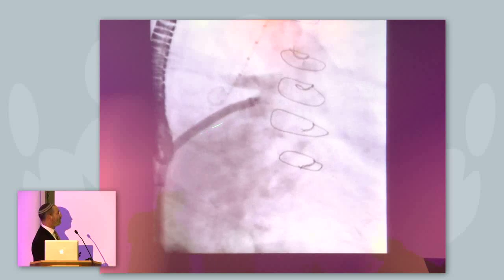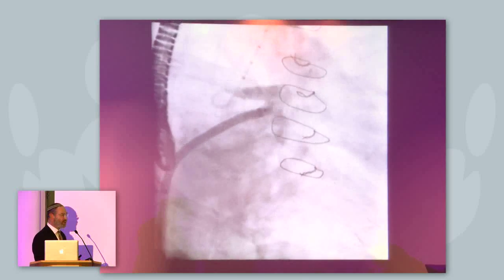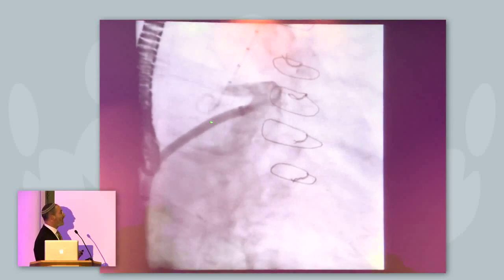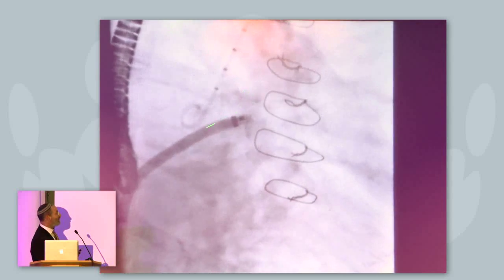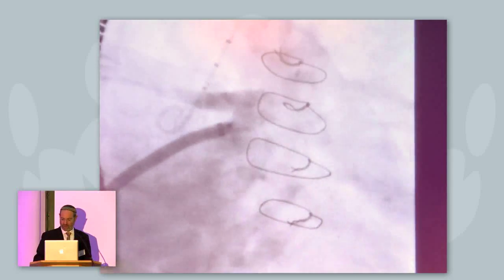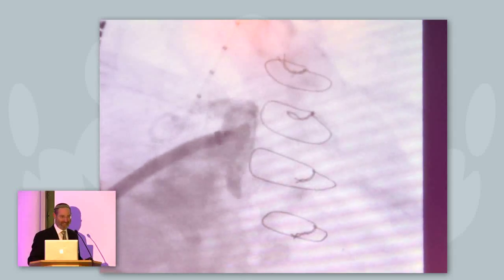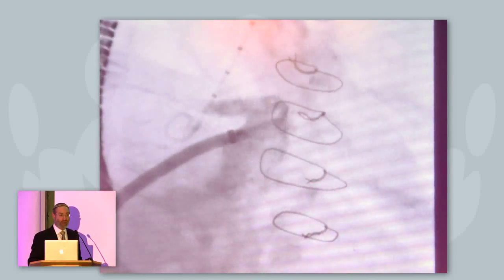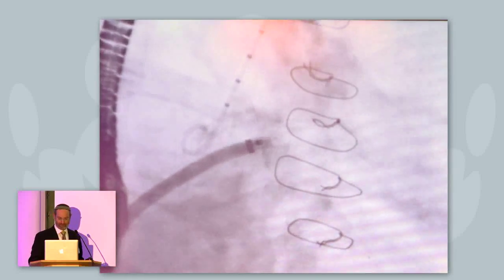I've got a 45 catheter, and it's clearly looking in the wrong direction. There is a possibility with a severe chicken wing of taking the sheath all the way round and trying to swing it up. I felt that bringing the sheath all the way back here would be applying an extreme amount of tension and potentially cause perforation. So I elected to try and reorient once I was already balled.